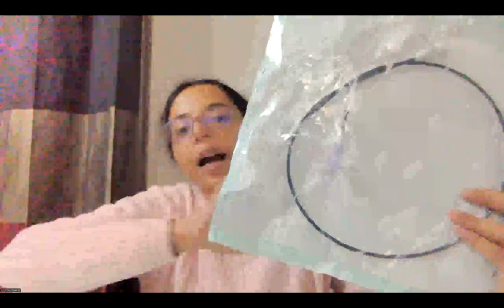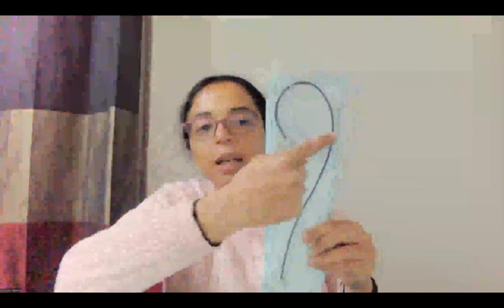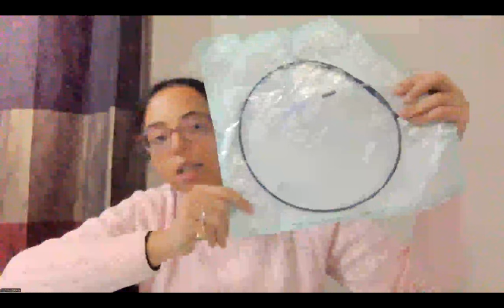So why are they used? They are used for additional support. In place of guide wires, these long sheaths can be used, or guiding catheters can be passed inside these long sheaths, or they can be used in place of guiding catheters. This is a crossover long sheath, when through one iliac vessel, we go into the other. So this bend sits on the aortic bifurcation. This is a straight long sheath and usually used in carotid artery stenting or distal intracranial procedures. So sheaths can also have different lengths, different diameters, and different distal shapes.